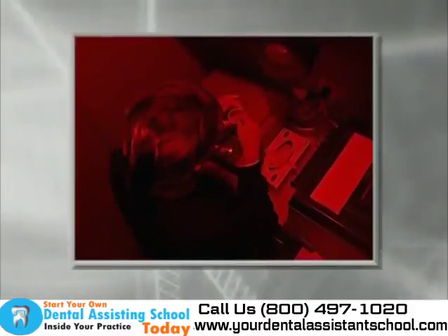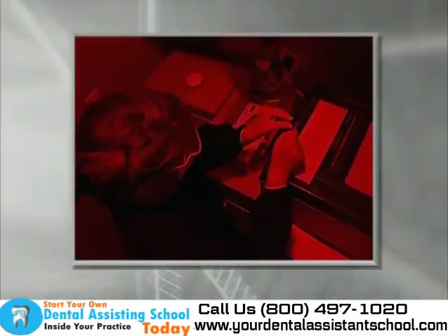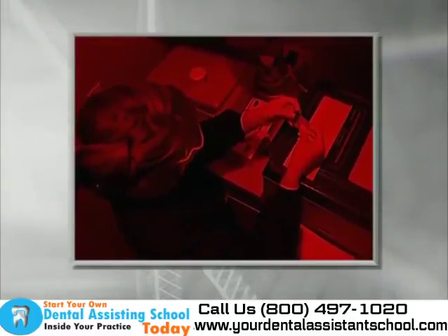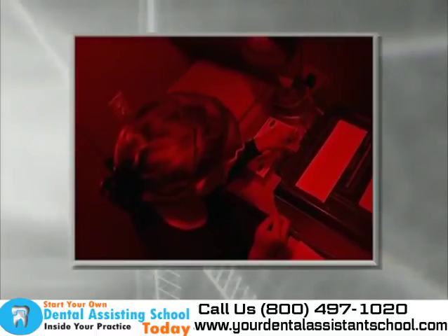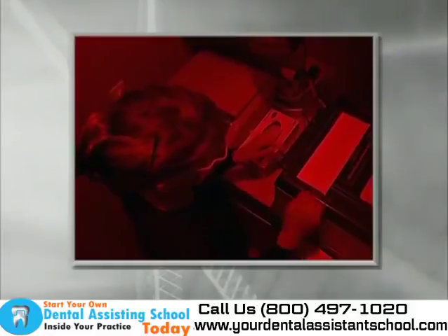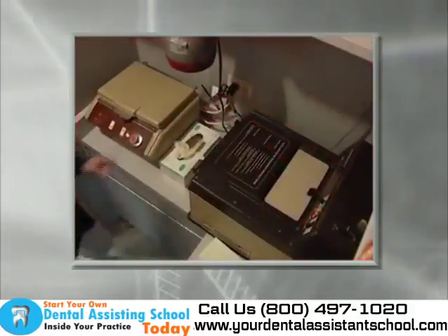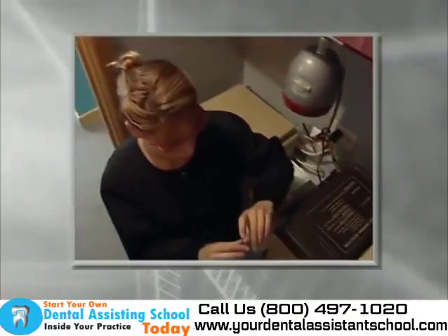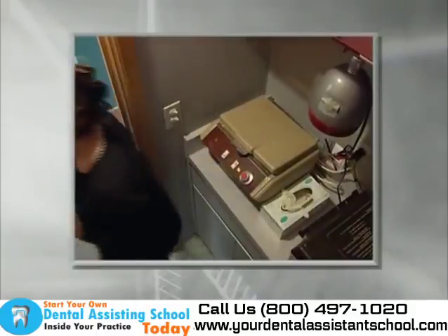There are many different types of developers available today. The developers used are chosen by dental practice preference. The dental assistant needs to be familiar with the X-ray machine used in her or his dentist's office, as well as the specific procedure for developing X-ray film. If uncertain about any portion of the X-ray procedure, the dental assistant should contact a supervisor for help.